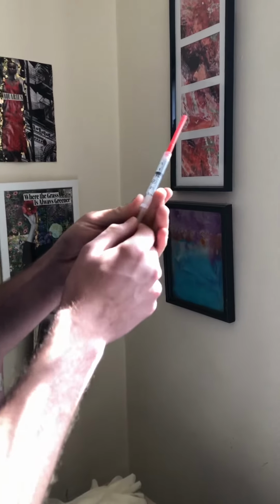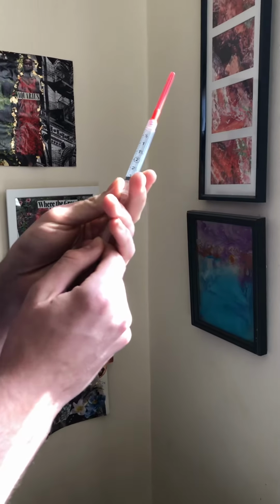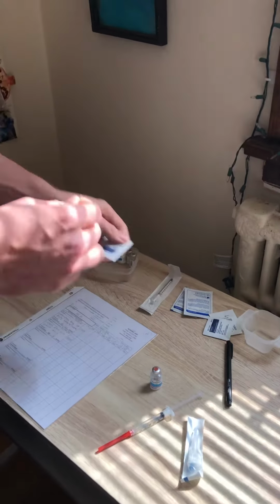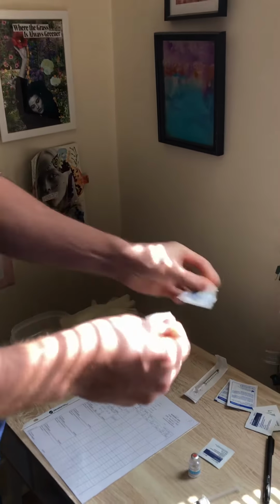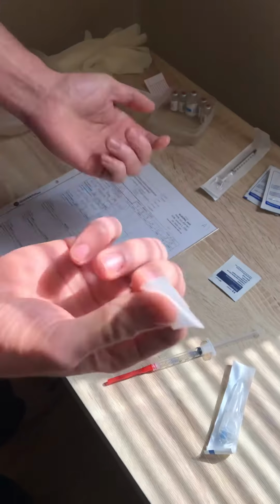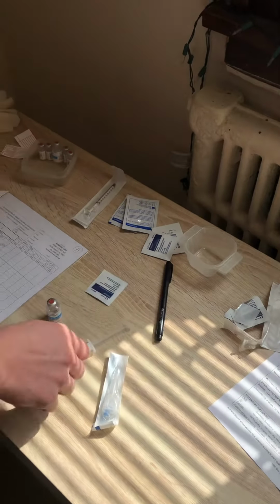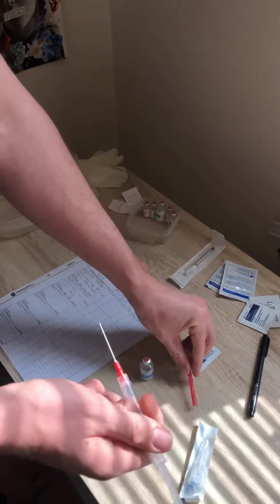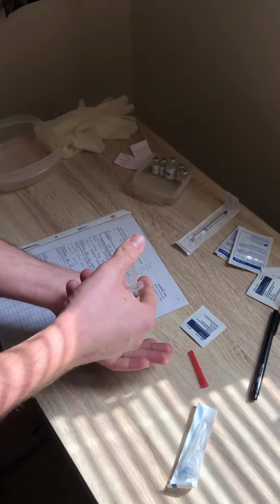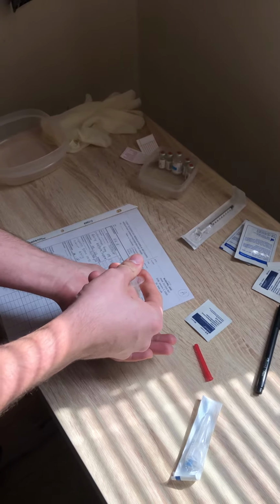Now I'll draw 3 mLs of air because that's how much I'm going to be drawing up from the vial itself. So I'm going to inject that into the vial prior. Okay, so now we'll have that ready. I'm going to get an alcohol swab and clean the top of the vial for 30 seconds in a circular motion. We'll just say that's been 30 seconds. So in the garbage with that. So now we'll uncap this, go into the container, and then we'll inject all of the air.